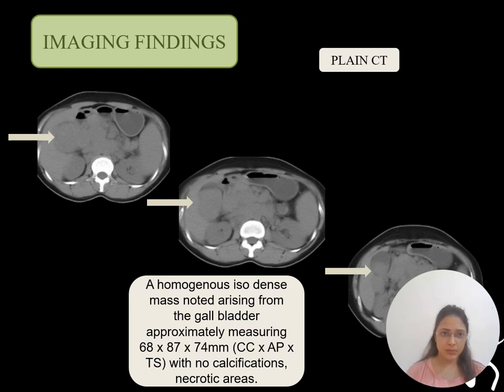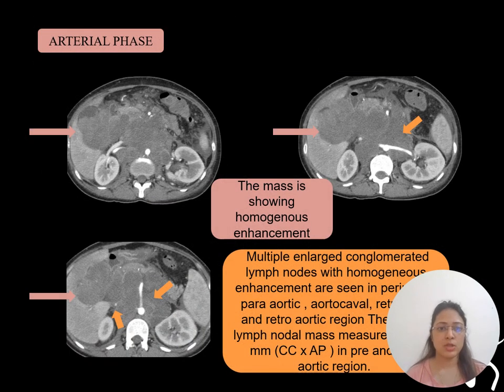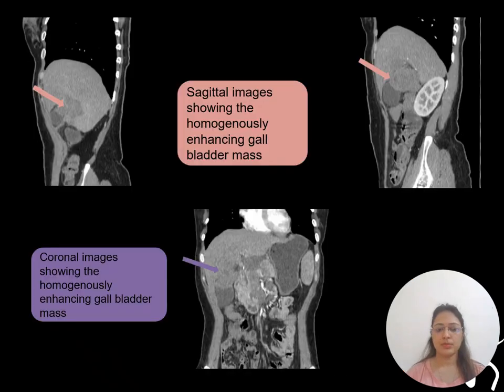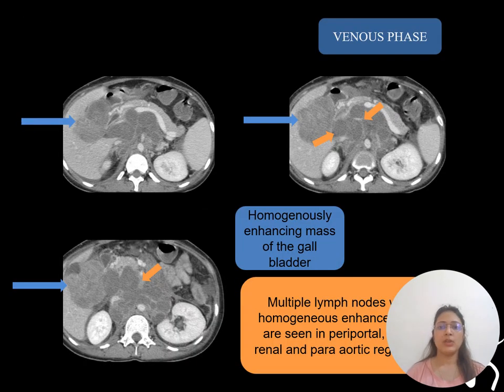After that, on contrast CT, the mass shows homogenous enhancement in the arterial phase, and there are multiple lymph nodes present in the pre-aortic, para-aortic, and peripancreatic regions. In sagittal images, there is also homogenous enhancement of the gallbladder mass. In coronal images, there is likewise homogenous enhancement. In the venous phase, the mass shows homogenous enhancement with lymph nodes in the periportal, renal, and para-aortic regions.